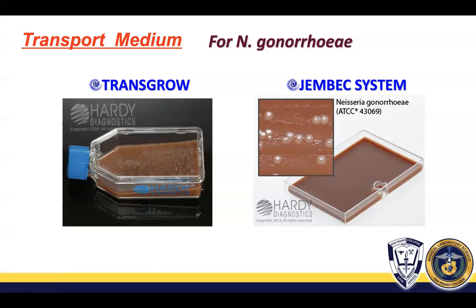Why? Because this bottle contains carbon dioxide gas. Okay, so it's heavier than air. That's why, to avoid it from escaping, it should be held upright so that it stays down into the bottom of the medium. Now, if the bottle gets tilted, the carbon dioxide gas can escape.